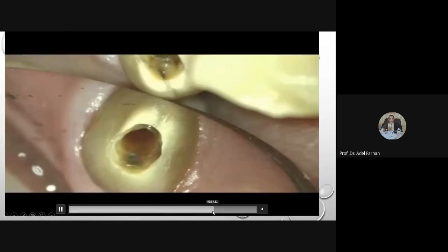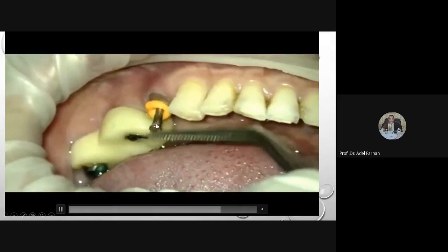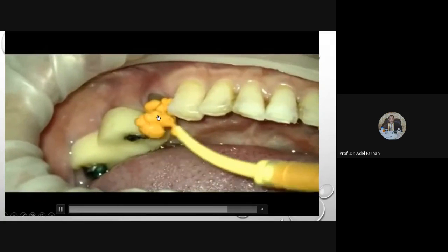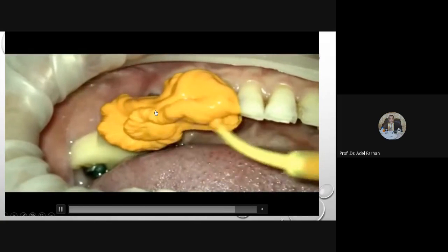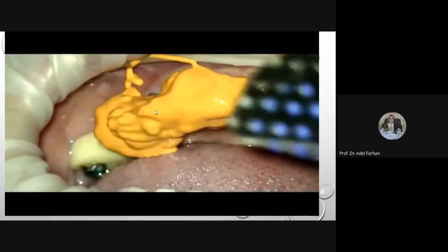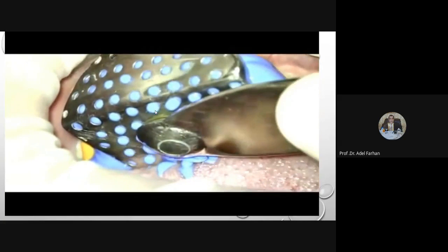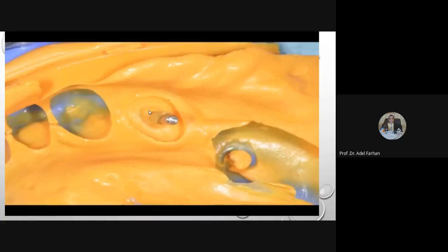Now هذا امبريشن شو استعملنا؟ شوف بالكنال نخليه يا اما بلاستيك بوست او ستانلس ستيل واير، وinject the material وندخله مع الماتيريال. هذا ايش راح يفيدنا؟ راح يسوي reinforcement للماتيريال so that during removal whatever the technique you use whether monophase or putty wash or heavy and light نحتاج هذا reinforcement اللي هو يا اما بلاستيك بوست او واير ميتال واير مثل وايرات الاورثو ممكن تستعملها.